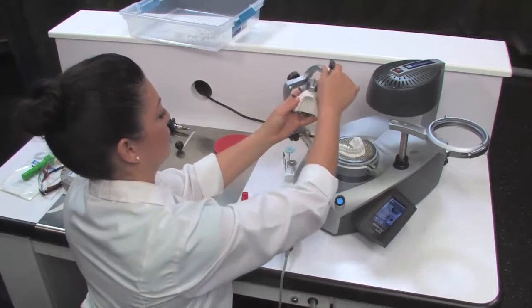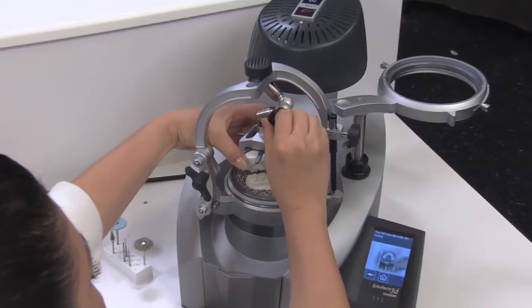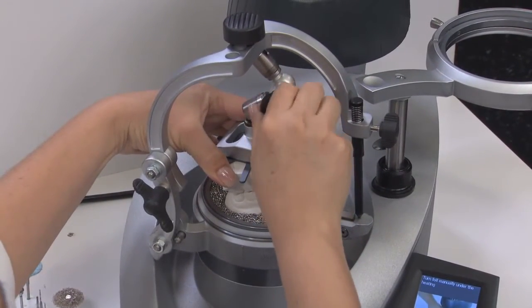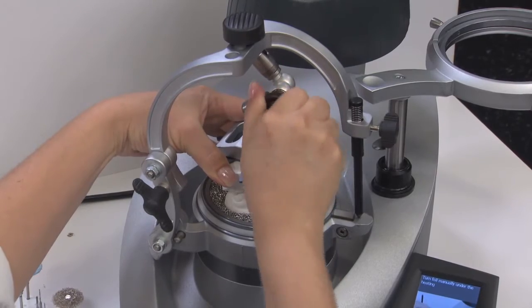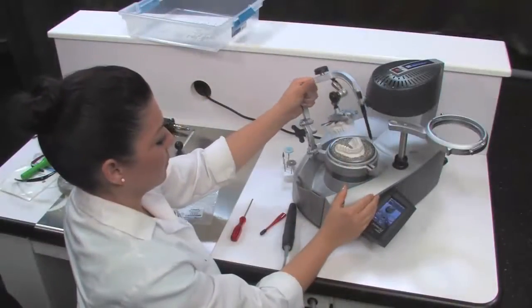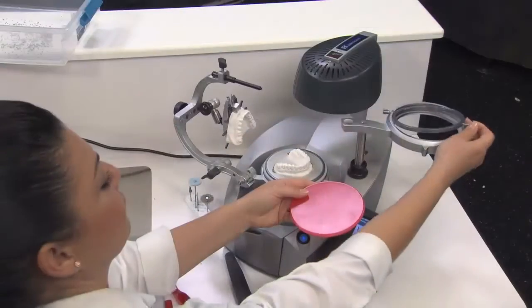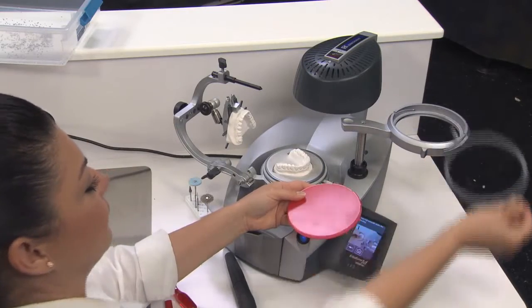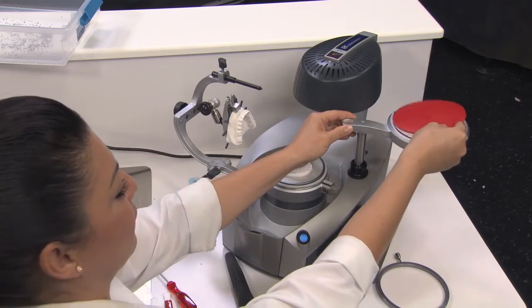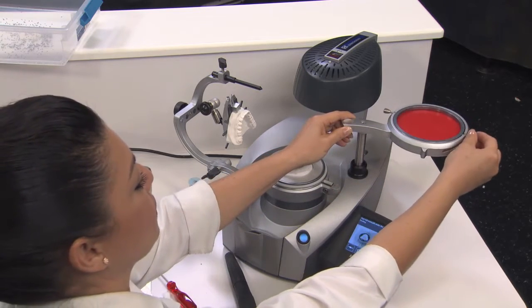Now, lower the Occliform. Loosen the thumb screw to allow the top model to come into proper occlusion with the bottom model. Once aligned, tighten the thumb screws. Lift up the Occliform and place a cover template over the granules. Next, remove the securing ring and place the PlaySafe Triple foil into the foil holder.